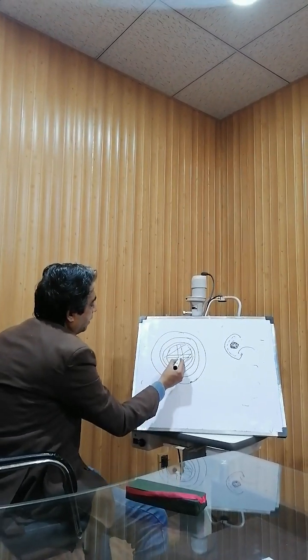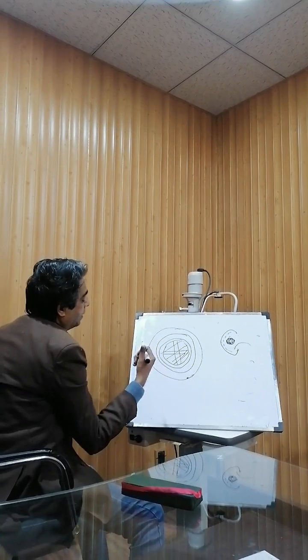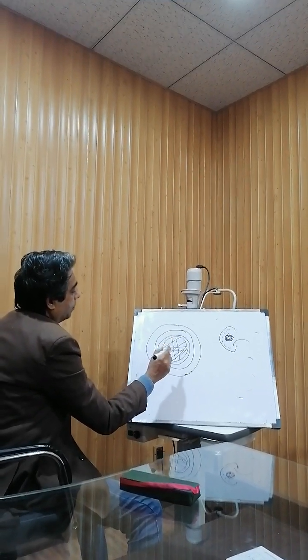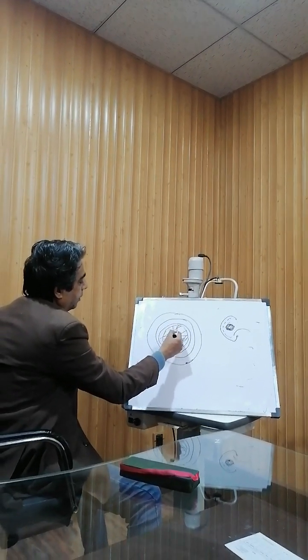Now, with the help of one instrument like a dialer and some other instrument, after injecting the viscoelastic so that the eye is formed, you will convert this nucleus into four parts, four quadrants. One this, second, third, and fourth.